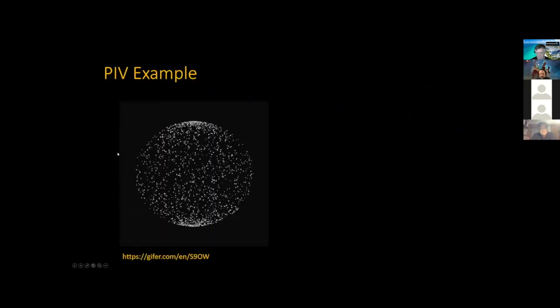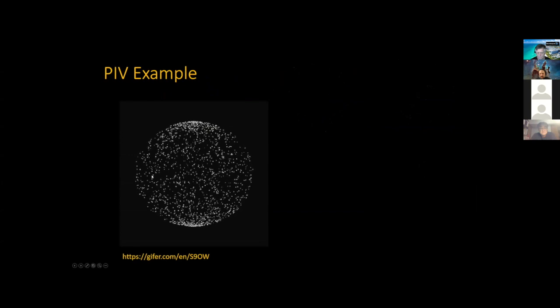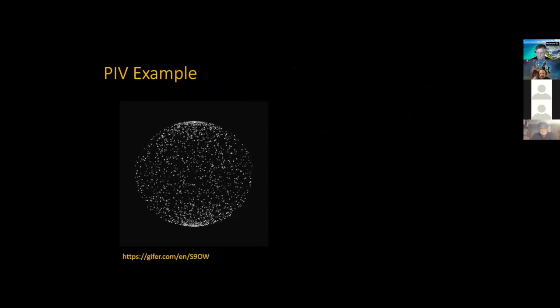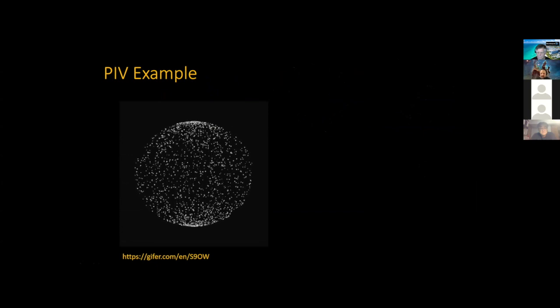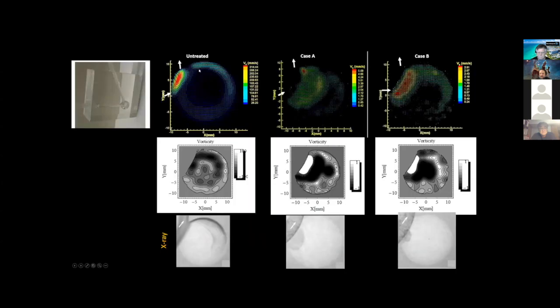How do we know that this is right? It is because we measure them, and this shows the concept. We pass particles through those phantoms that I showed you, with a laser. We shine the laser and we track small particles all around. All these particles are being tracked, and that gives us measurements like this. So we know exactly how the flow goes in. And when we look at the contrast, how it goes in, it follows to a certain degree.